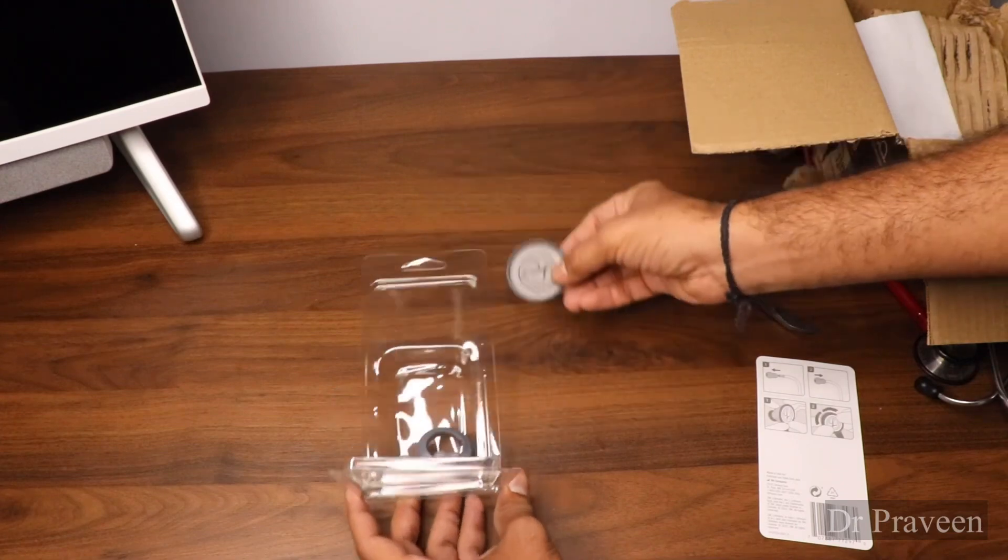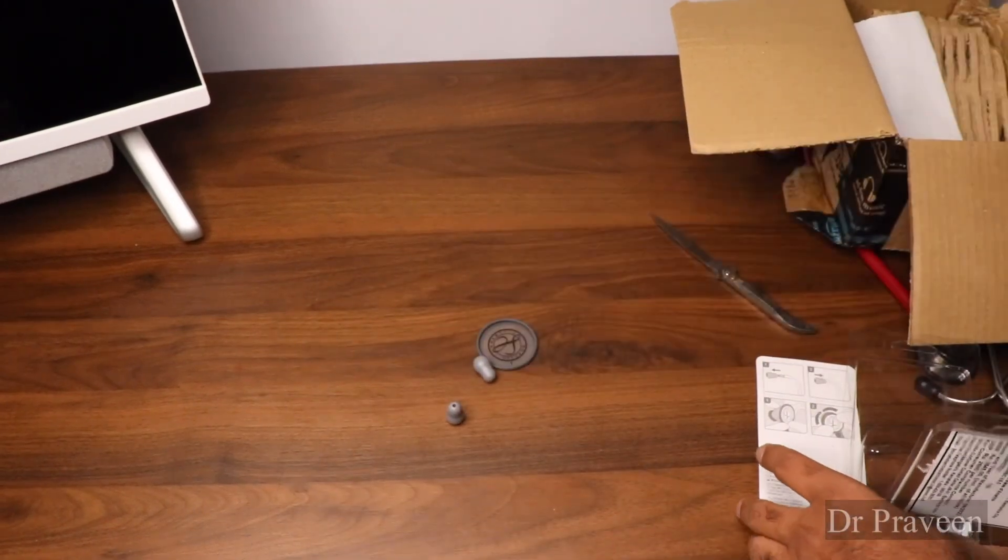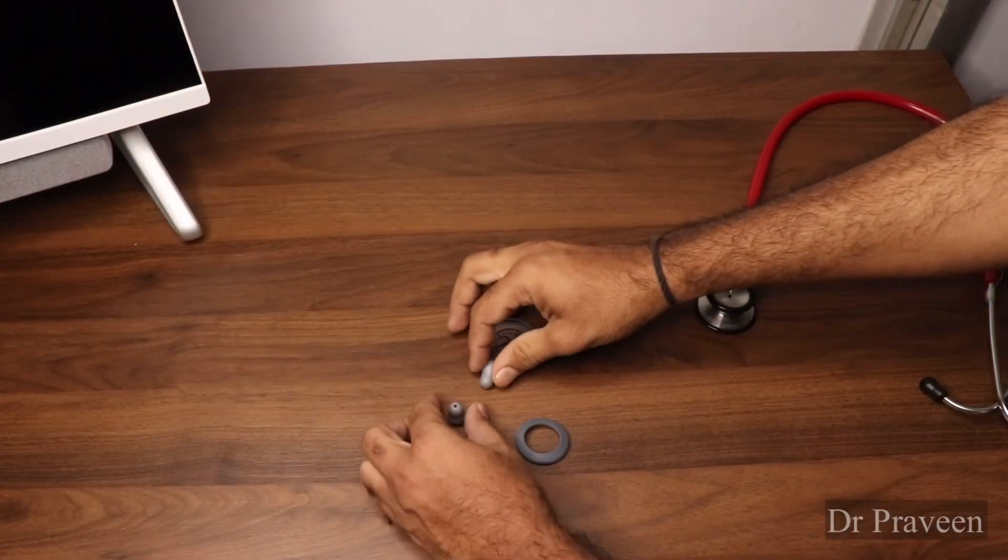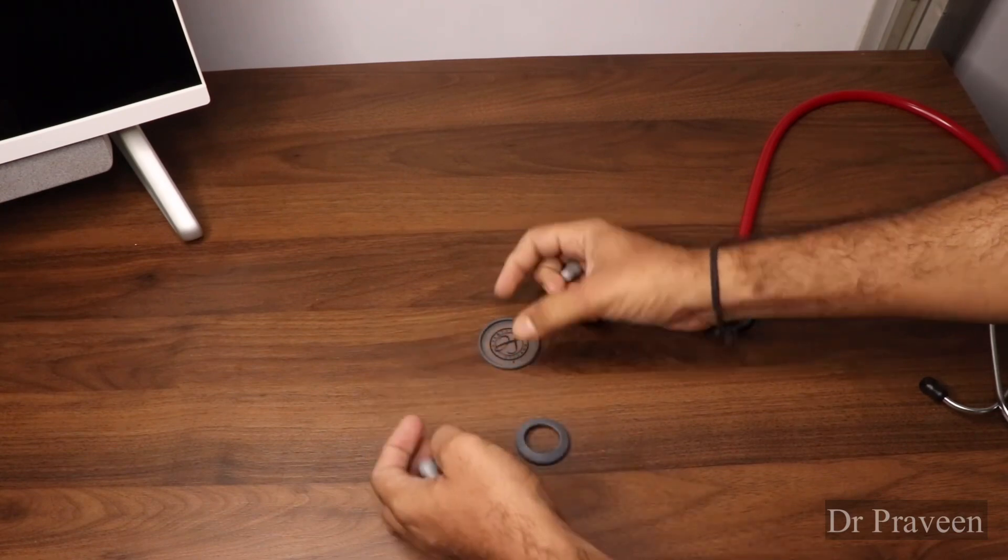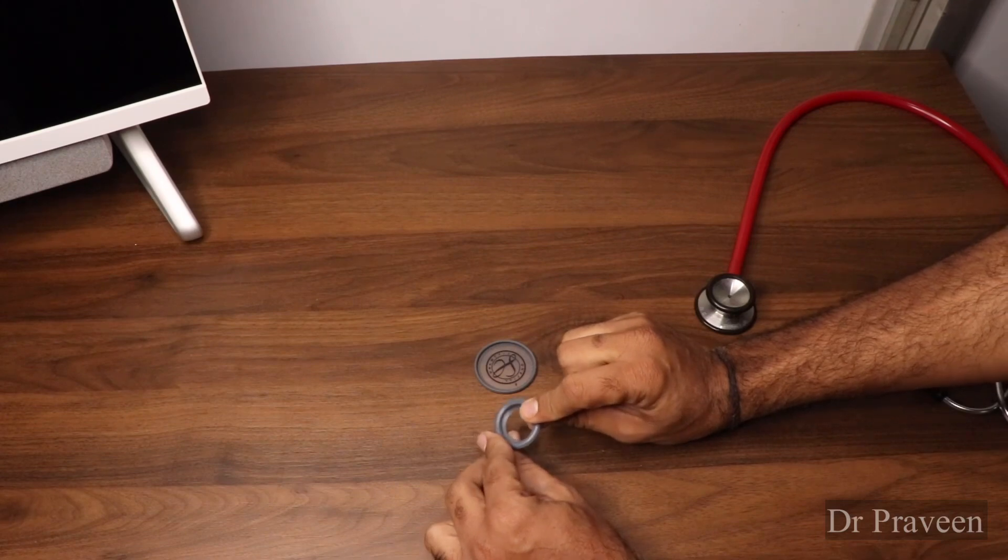This is the diaphragm we got. Two earpieces, these are the new pieces. One diaphragm we get and another one is for the posterior small chest piece.